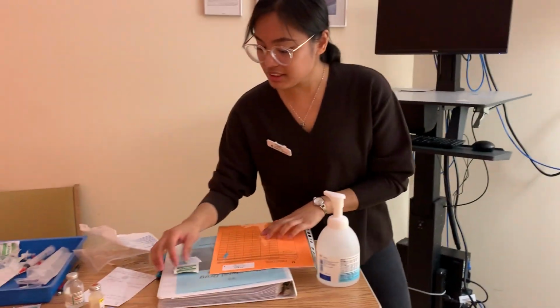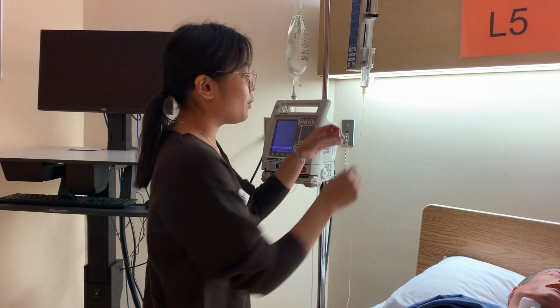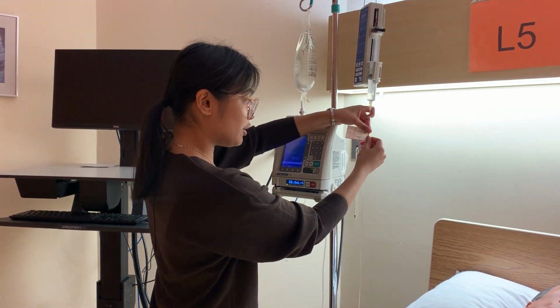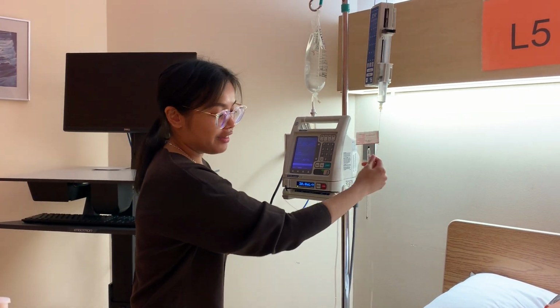I'm going to put my IV tape, which I have here, with my name, designation, and the time given. This lets the other nurses know when the IV tube can be changed to prevent complications such as allergic reaction, bacterial contamination, which can cause infection, and all that sort of thing.